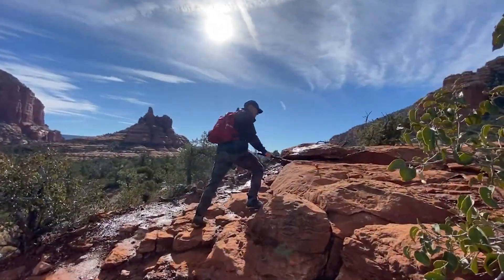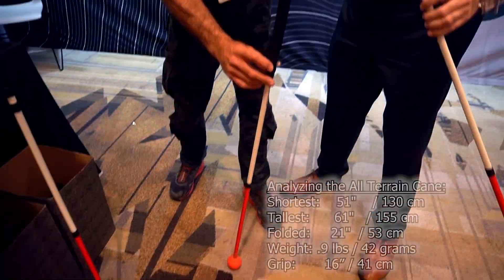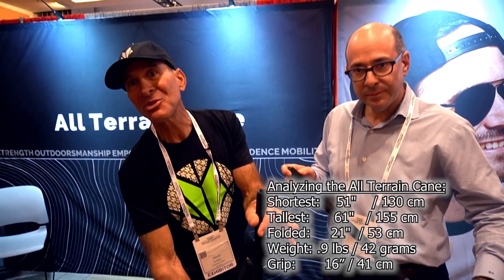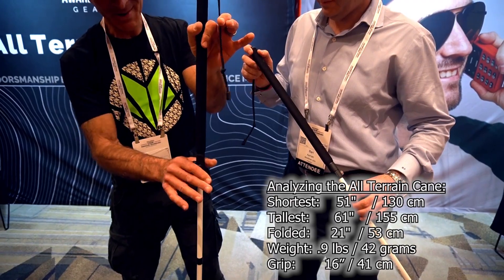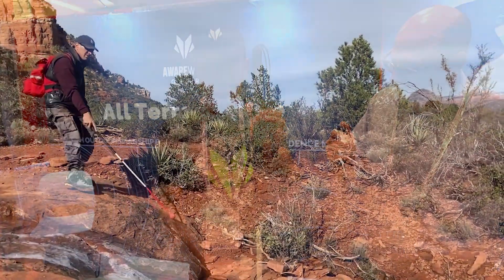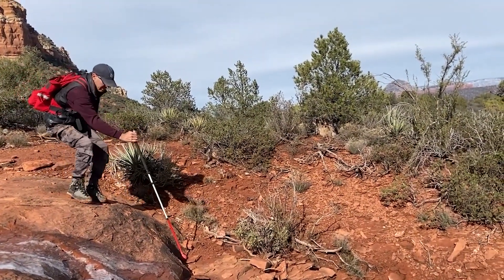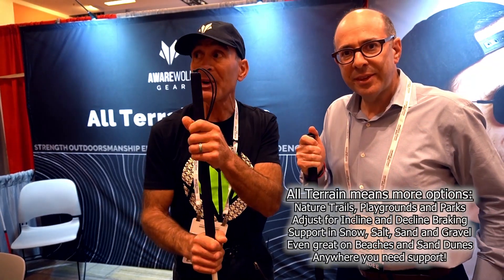Off-road, in the wilderness — it has a 16-inch grip with a flip lock that allows you to adjust this cane from 51 to 61 inches. Titanium alloy, super strong, super lightweight. This is what I need to keep me safe on the trails of Arizona. Balance, support, braking — but not just on the trails. Beaches, parks, playgrounds, snowy environments. Wherever we need support, this is going to get us there safely.